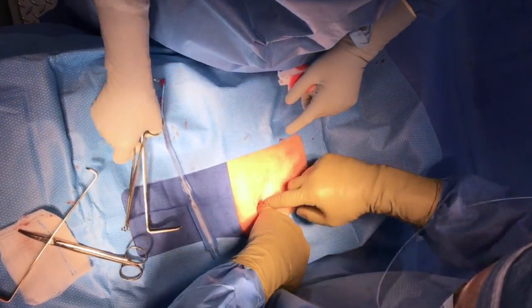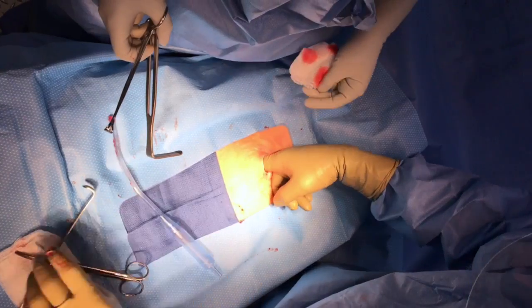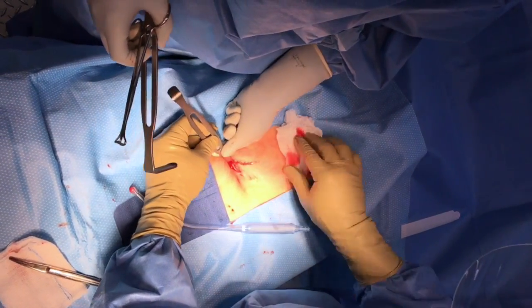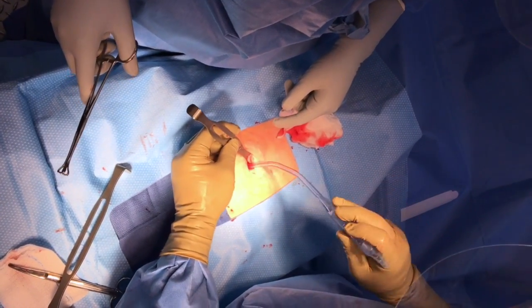You just need an incision big enough to stick your finger in. Use your finger to see what the suction tip will do — slide it behind the fundus and elevate the tube. With a retractor placed, it's usually best if the surgeon holds the retractor herself.